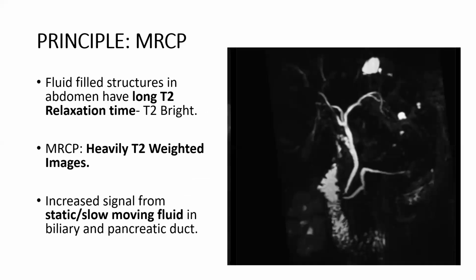So the principle of MRCP is that fluid-filled structures in the abdomen have a long T2 relaxation time and appear bright on T2 weighted images. MRCP utilizes heavily T2 weighted images in which the increased signal is obtained from static, slow moving fluid in the biliary and pancreatic ducts.